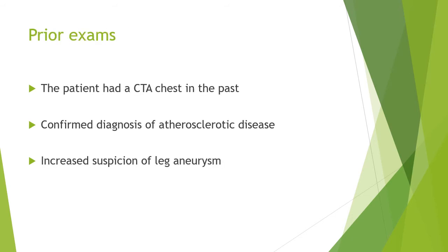The patient's medical history also showed a prior CTA chest exam several years ago for different symptoms. The report for the exam explained that the patient had atherosclerosis. This diagnosis of atherosclerosis increased the suspicion for a leg aneurysm.